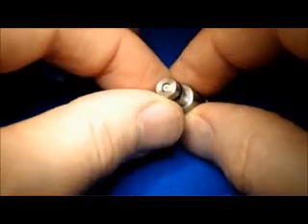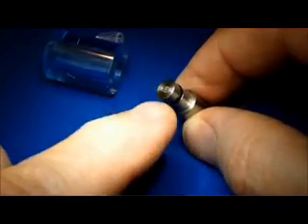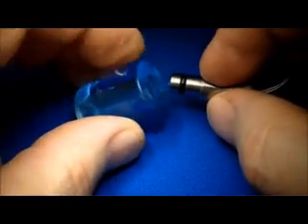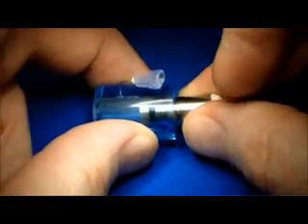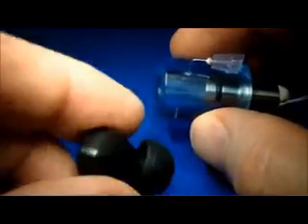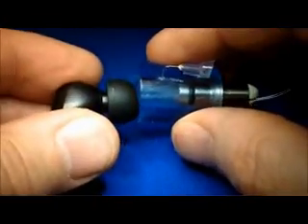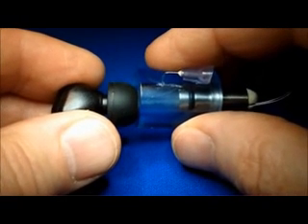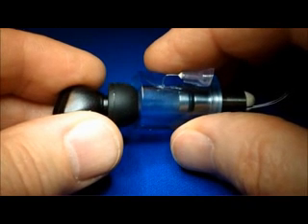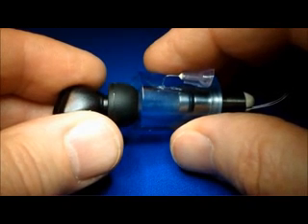To give you a bit more insight, that small microphone has been placed in this holder, and this device I have here in my left hand could represent the trapped volume. So the microphone would be in the trapped volume, and then the earpiece would fit over the end and seal tightly. So the volume you see between these two would represent the trapped volume in the ear canal.